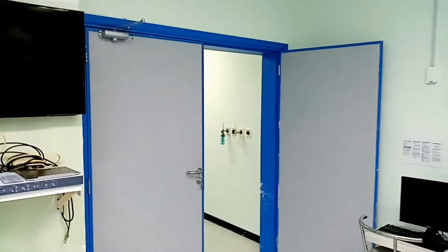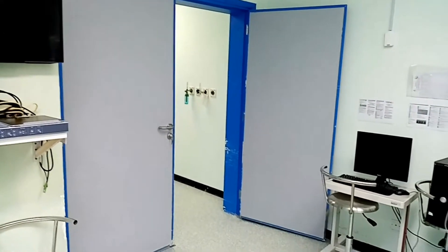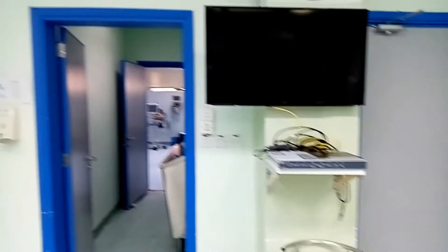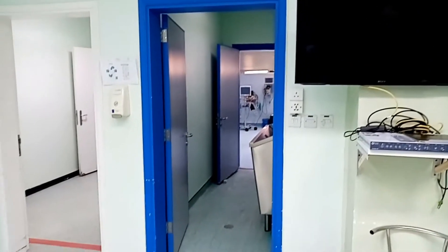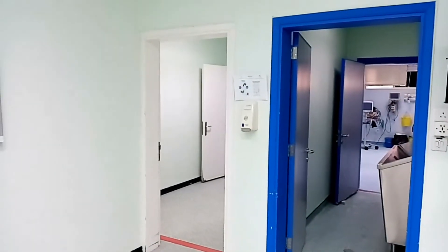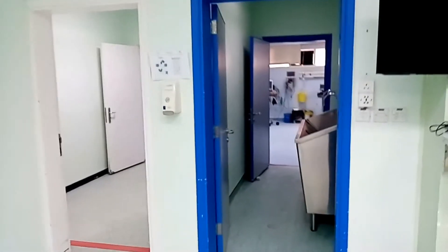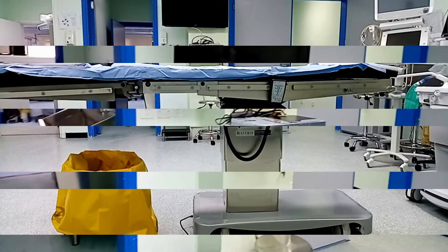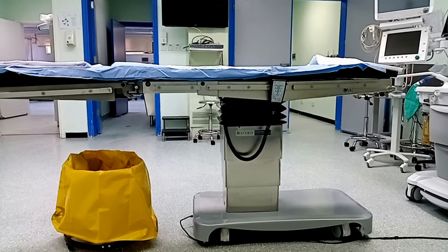السلام عليكم ورحمة الله وبركاته. سريعاً هنتكلم معاكم عن تجهيزات غرف العمليات. ده باب دخول المريض، وده الباب اللي بيدخل منه الطاقم الطبي بعد التعقيم، وده حوض التعقيم اللي واضح قدامنا. وده باب خدمة إضافي في الغرفة.